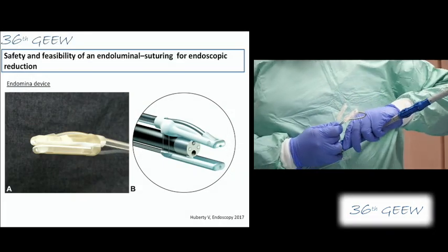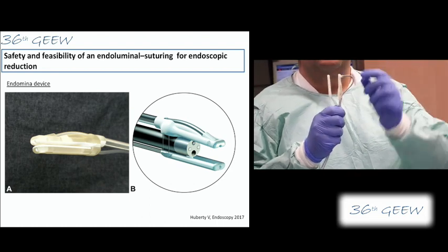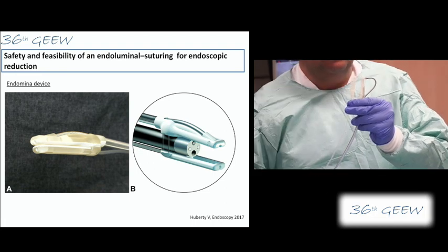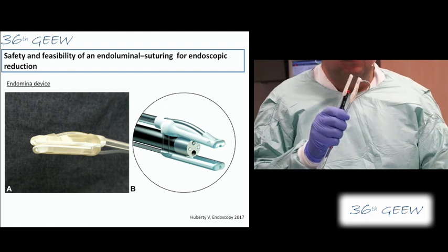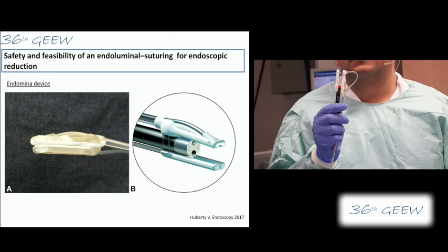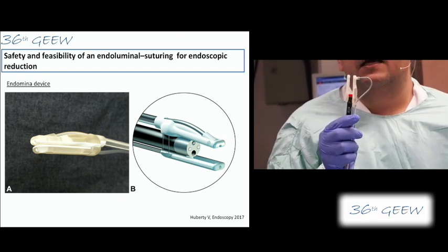I will bend the arm first like this — you can see now this is the bendable arm. Normally what Vincent will do now is place the scope here. You can open and close it, and this is one of the good things about this technique: you can at any time during the procedure open the Endomina and take your scope out.